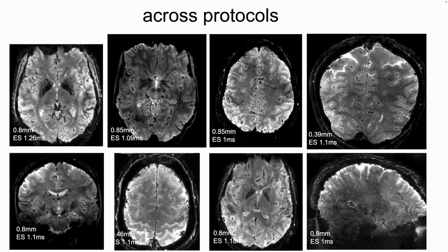We looked at all the protocols that are being done in our center. Some people try to focus more on visual cortex, some people do auditory research, some people do very high resolution, some people do motor cortex imaging, and we always see these fuzzy ripples that completely go away as soon as we unplug the third order shim.